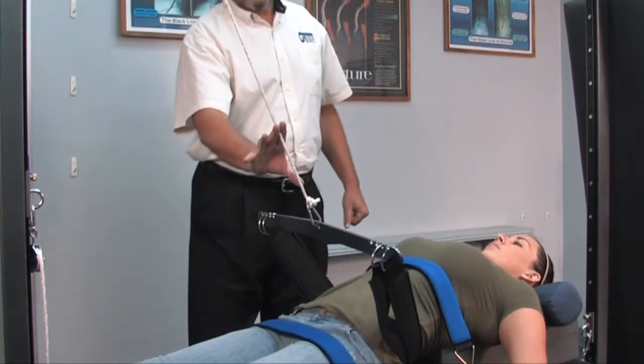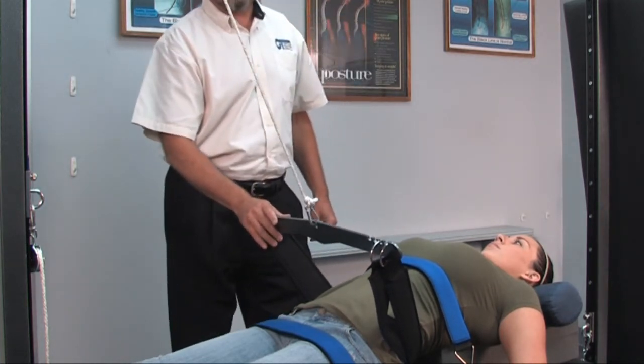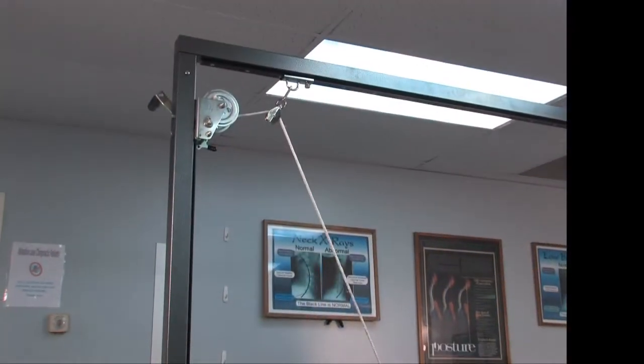If we have a scale — we do have a heavy-duty scale that can be used with this setup — you can monitor how many pounds of pull you're doing, or you can simply do it to patient tolerance.